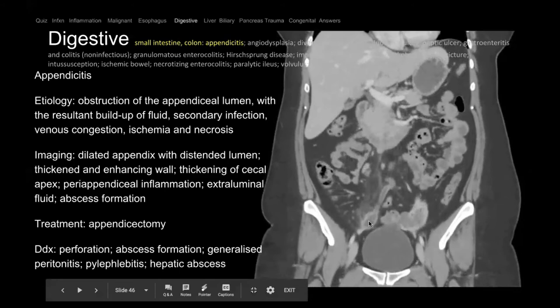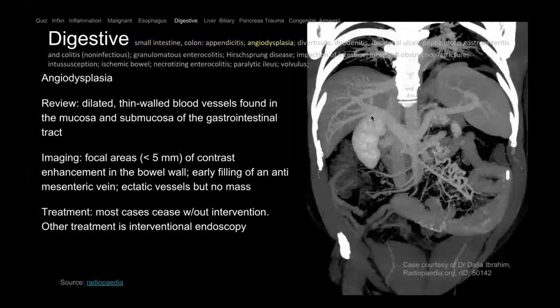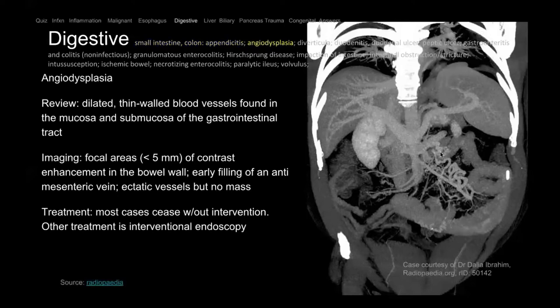Here is a MIP image of the abdomen and pelvis showing kidney, liver, spleen, portal veins, splenic vein, and SMA/SMV. There are abnormal tortuous little vessels — this is called angiodysplasia, an abnormal AV malformation. This is important because it can bleed and cause GI bleeding. If found, interventional radiologists can embolize it — targeting the abnormal tangle of vessels — similar to liver mass embolization.